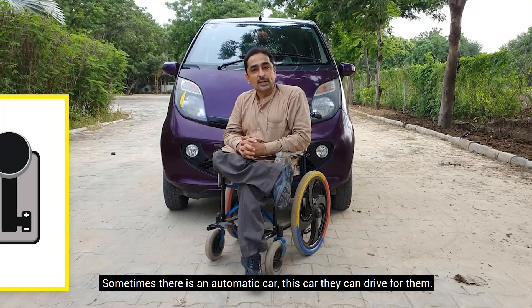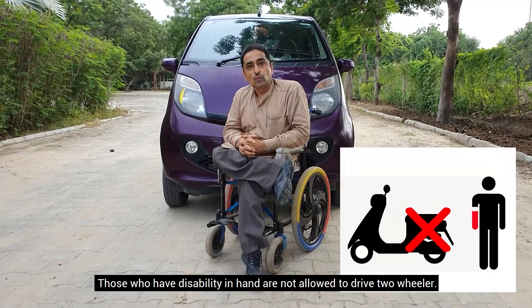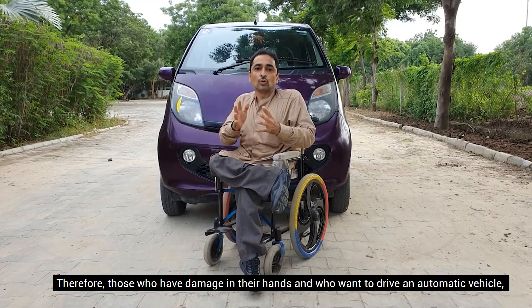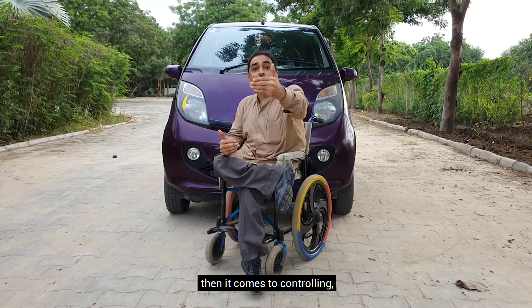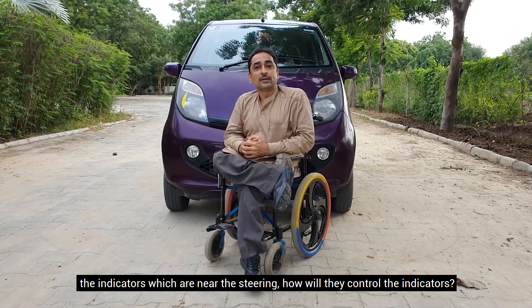If there is an automatic car, the person can drive. There is no two-wheeler allowed for them to drive. The challenge is controlling the car with one hand. The indicator on the steering wheel — the indicator of the steering — needs to be controlled.